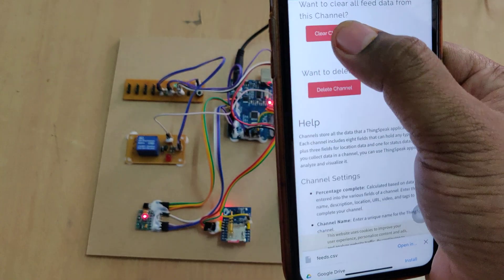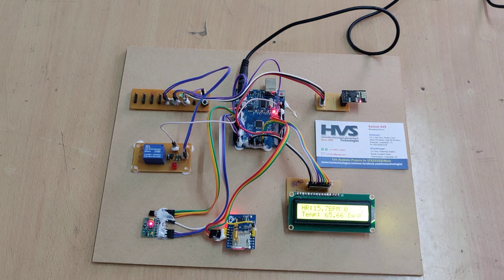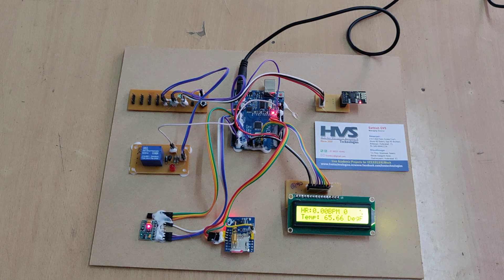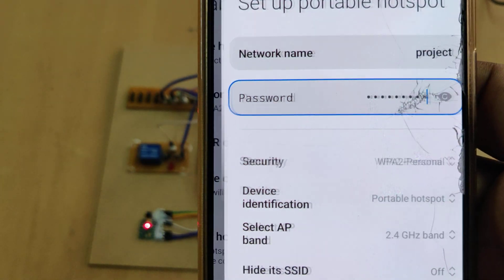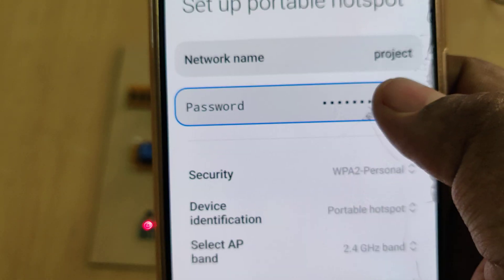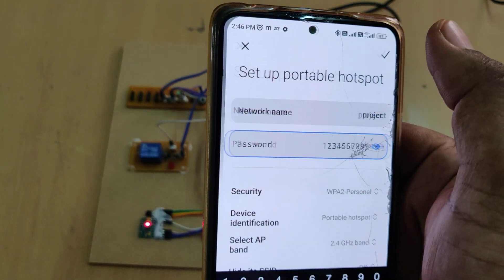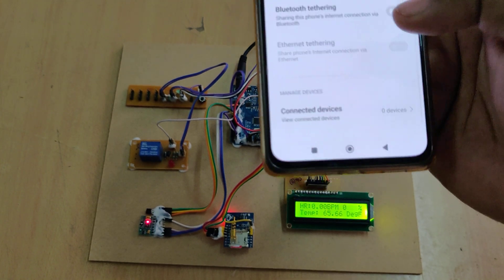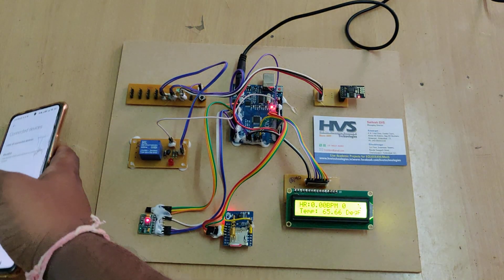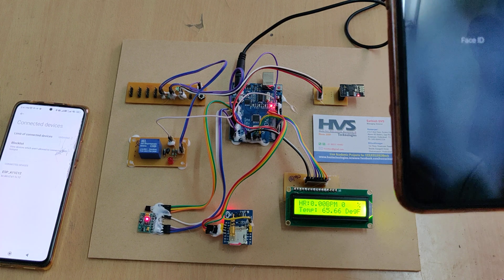Click 'Clear Channel' to erase the data. Before switching on the kit, we also need to enable a hotspot with the name 'project' and password '123456789'. Once the hotspot is enabled and the kit switched on, the ESP8266 device will connect and upload sensor data to the ThingSpeak cloud platform.